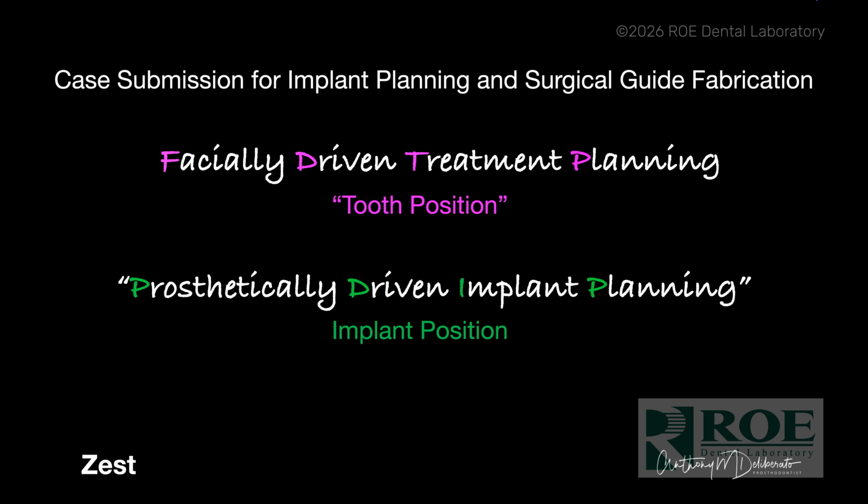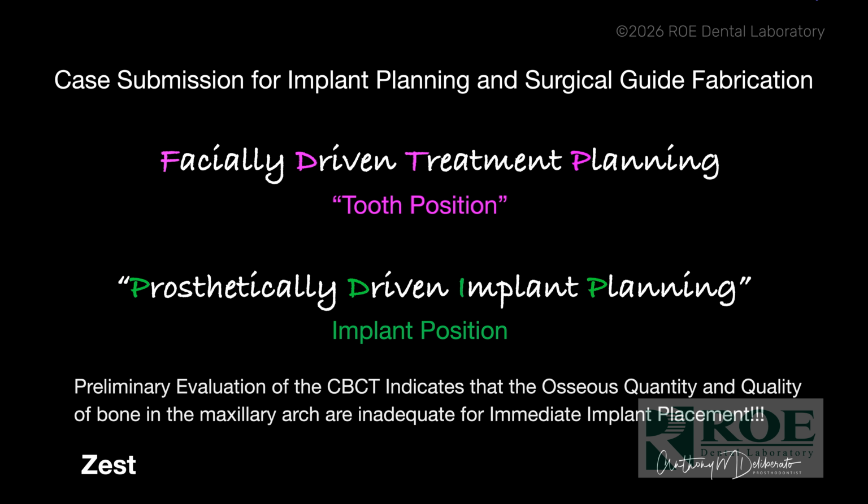And then once we know where the teeth are going to be within the face, now we can place the implants in the proper position to be in the confines of the planned tooth position and not in a position where the teeth have been shifting and drifting, because it's going to introduce inaccuracies and cause the outcome of our case to be far from ideal.